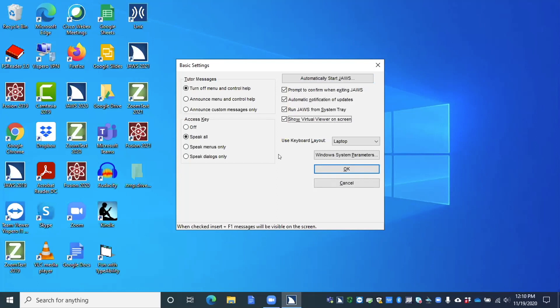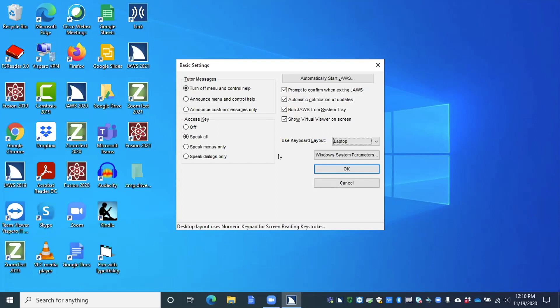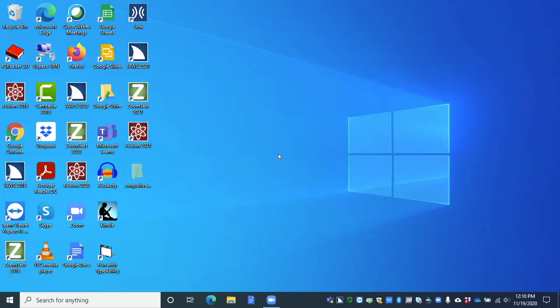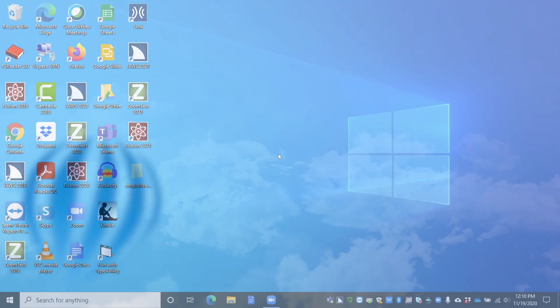And use keyboard layout combo box laptop. So let's say you want to change the layout of the keyboard layout. For example, if you were using a desktop computer or a regular keyboard, you had it on desktop. Now you have a laptop and you don't have a numpad, for example. You want to be able to use the caps lock as your insert key. You can go here and change it to laptop. And you can just use your arrow keys to navigate through that box there. Windows system parameters dot dot. And I'm going to tab to OK button, and I'm going to press the enter key. So that's just the basics there. And once again, you'll see a lot of these settings overlap in different places. You'll find the same settings in different places.